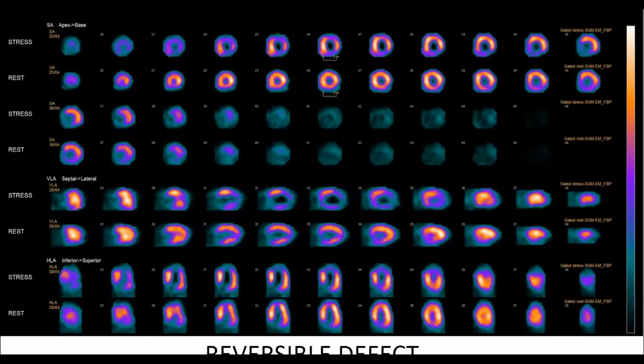There is an anteroseptal defect as well, and on the apex as well. On the apex you can see there is return of uptake. These bright spots here, some are partially reversible, meaning they show decreased uptake. Here it is showing uptake a bit, but it's not completely reversing, it's partially reversing. So this is showing a reversible defect.